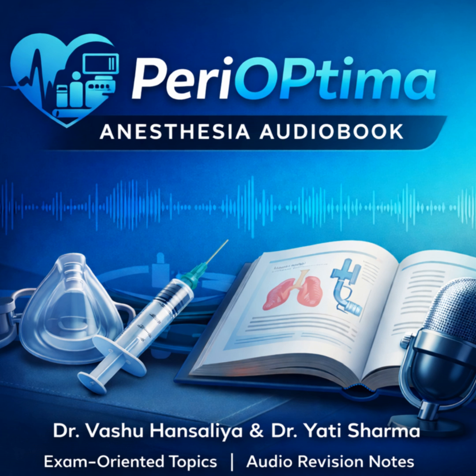For the VIVA, what's the crucial final exam-oriented comparison point, the summary statement? You should never equivocate on safety. You must conclude that in scenarios involving high aspiration risk, so morbid obesity, an emergency, a full stomach, the ETT remains the definitive gold standard. However, you then demonstrate your nuanced knowledge by stating that second-generation SGADs are now considered adequate and safe alternatives in selected non-high-risk cases because of their improved seals and the critical inclusion of the GDC. The choice is always a risk-benefit assessment.